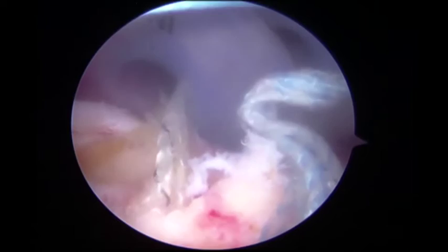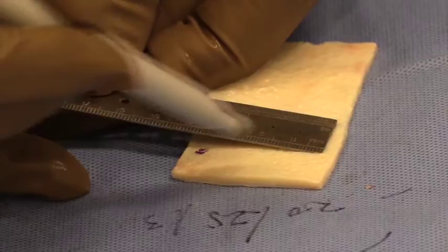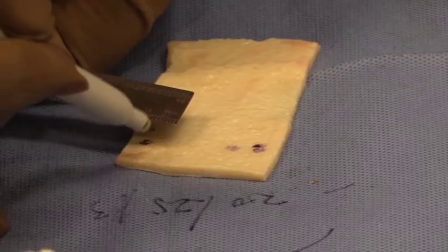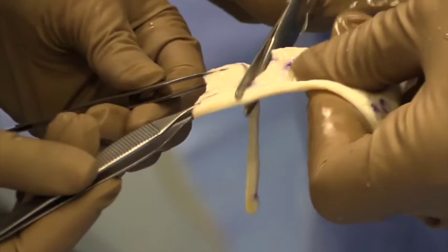Careful attention was paid to prevent the sutures from overlapping or intertwining with one another. A 3-millimeter thickened dermal allograft was then prepared based on the anterior-to-posterior and medial-to-lateral distances, with 5 millimeters added to each side.